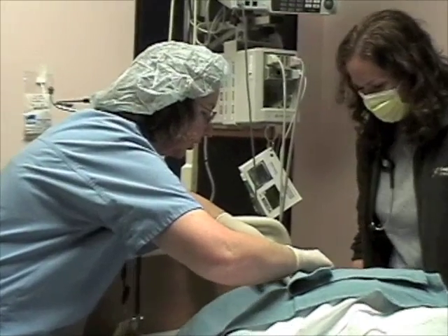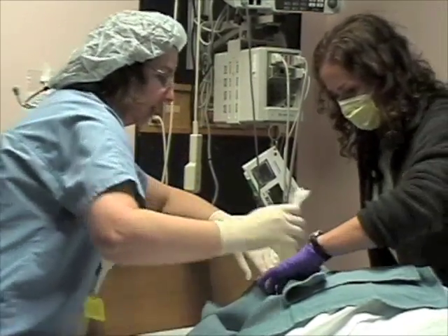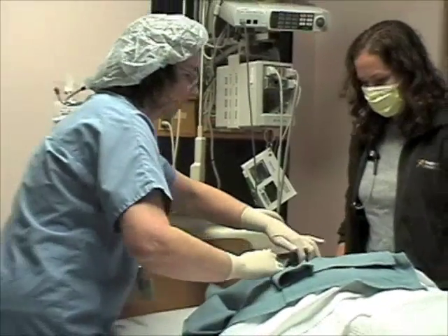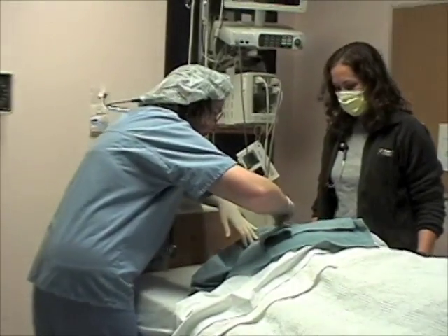So I'm just going to clean with the — don't move. All right. Let's get this out of there. Okay, good. How does that look to you? Good. All right, so do we get started? Yeah, let's get started.